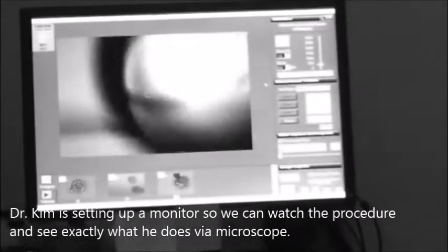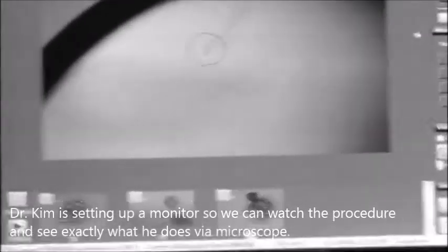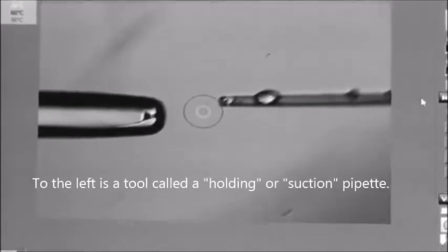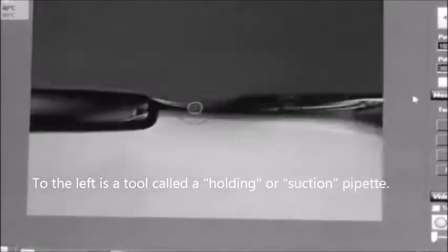He is setting up the screening and we're going to look at the screen here to see what he is actually looking at underneath the microscope. To the left is the suction pipette for holding the embryo.